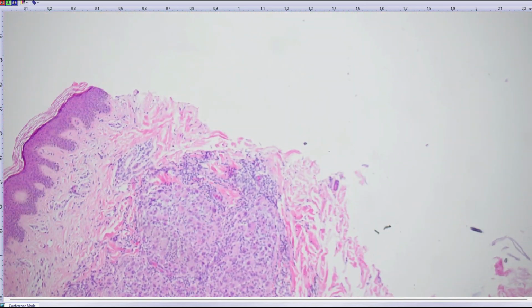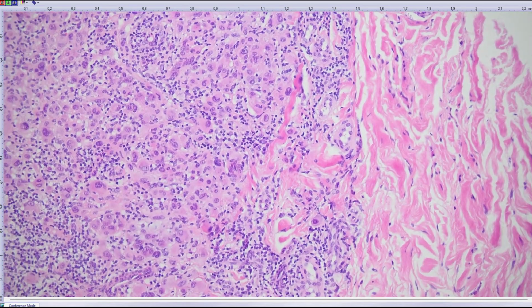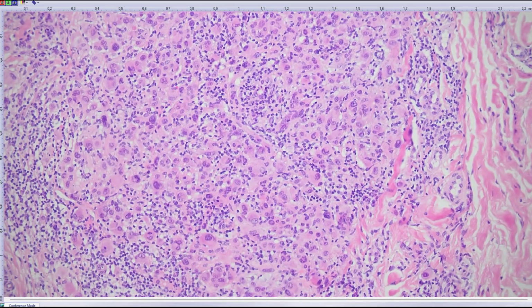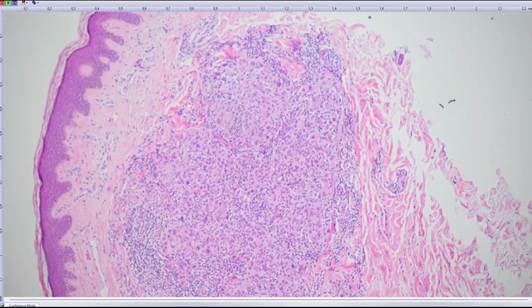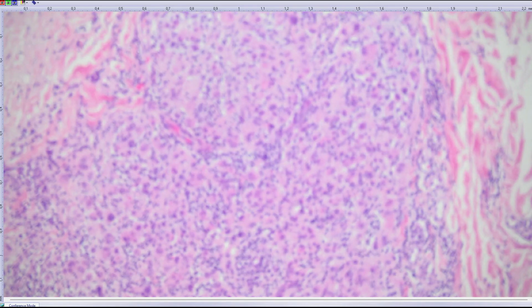Another case, I've shown several cases in the past, but this is a very nice instructive case. A pigmented lesion of the skin, and I think that without further examination, most people would call it malignant melanoma. It is S100 protein positive, tyrosinase positive. Is it BAP1 deficient? Yes, but I have here BAP1, and we have now maybe one BAP1 deleted lesion every 10 days now. I don't know how it is possible.